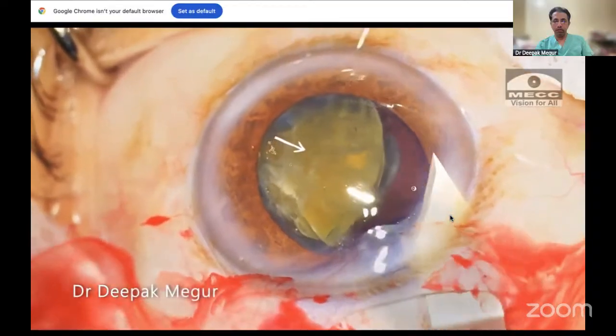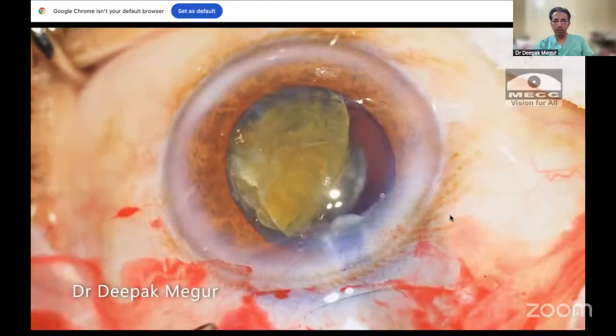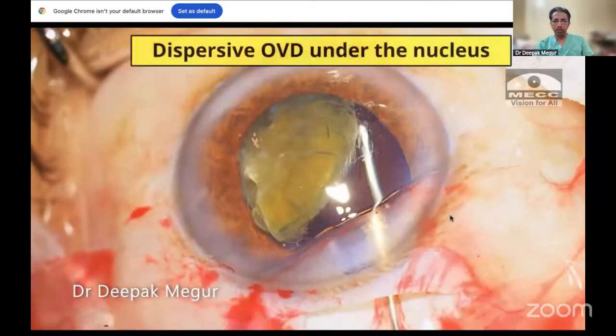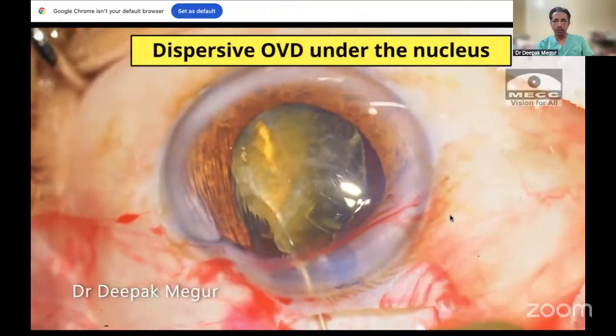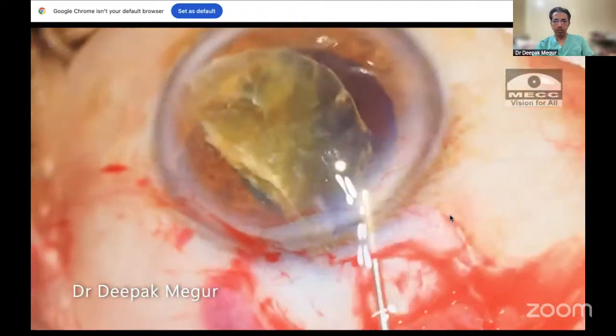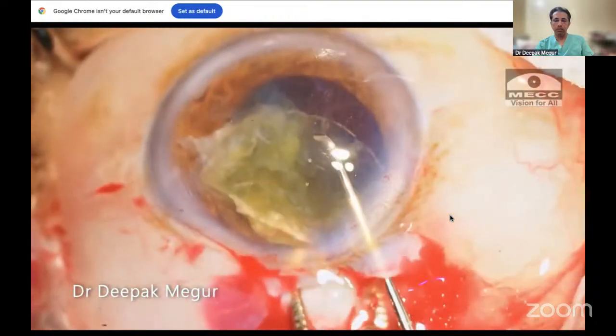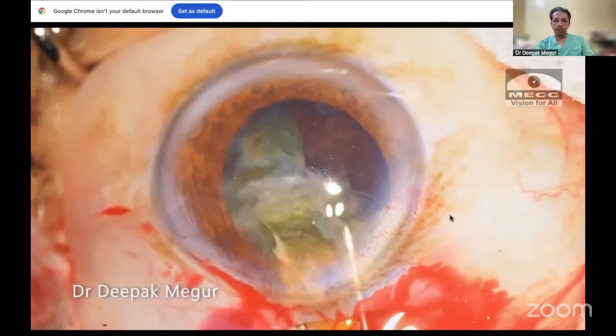As a result of this, the nuclear fragments have also moved anteriorly. This was a blessing in disguise. Dispersive OVD is injected under the fragments. One fragment has floated up into the anterior chamber. OVD is injected above the fragment and under the corneal endothelium. Using the sandwich technique, the heminucleus is guided out.